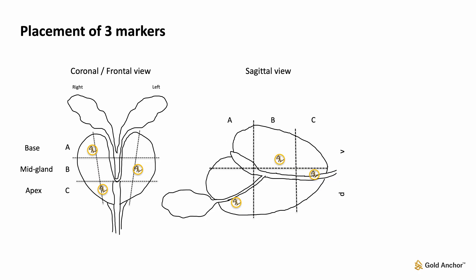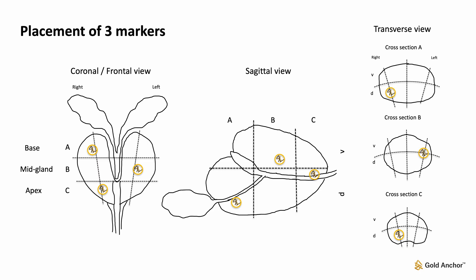Three markers are shown including a sagittal view, with the Gold Anchor markers well distributed in the dorsal-ventral direction. Images of the three Gold Anchor markers in coronal, sagittal, and transverse views demonstrate well-distributed placement in all directions.